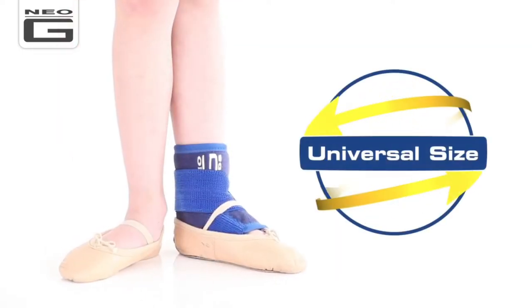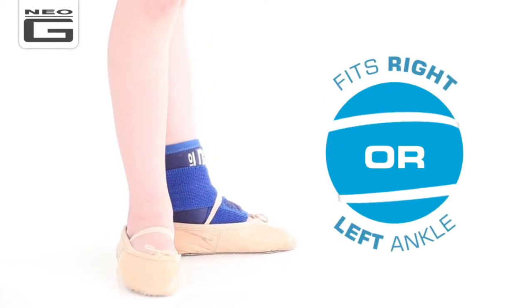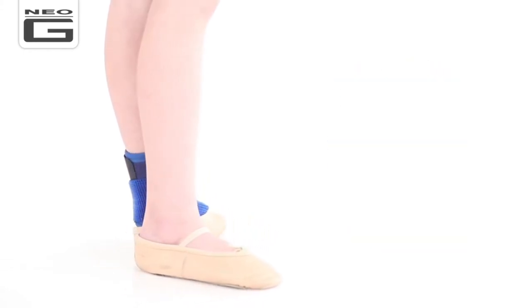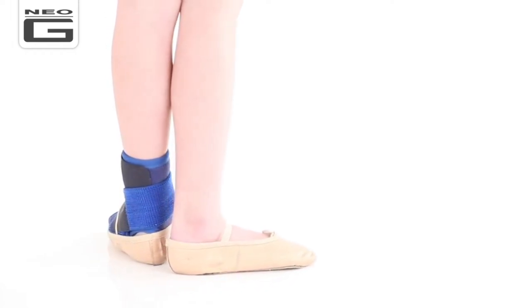Universal in size up to approximately age 12 and adjustable for best fit, this support fits both left and right ankles. The adjustable Figure of 8 Strap helps provide added support and compression for weak and injured ankles during sporting and recreational activities.